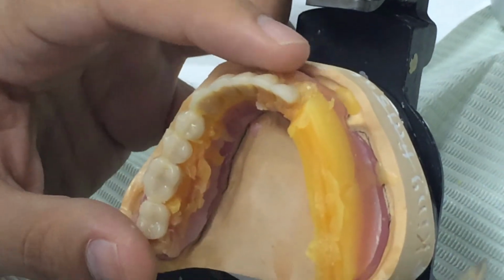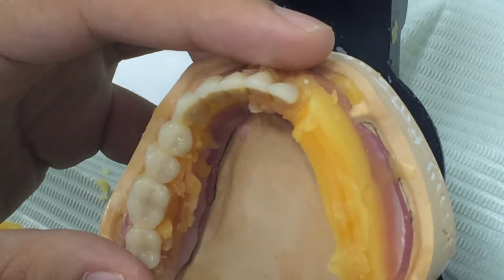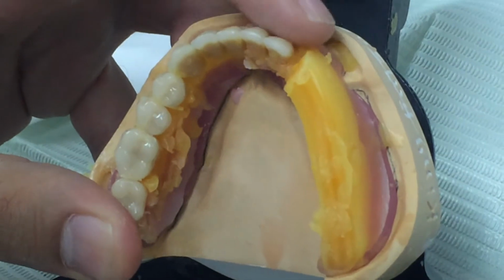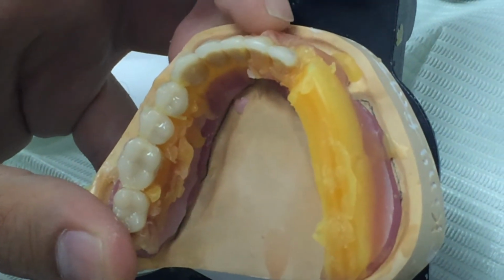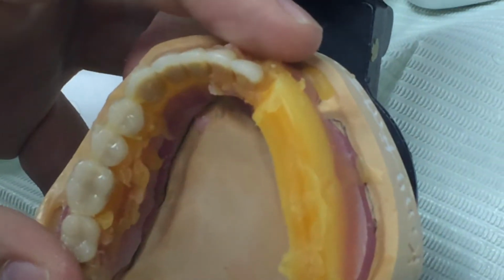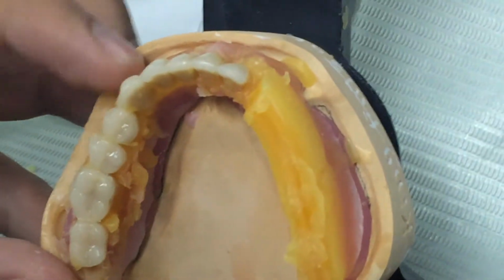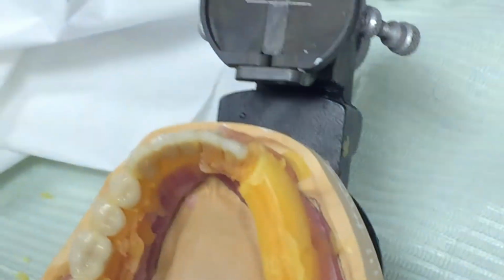So the next, you cannot see it clearly here, but you have seen it by your eyes, where you can easily determine. Let's say this is clear for you. This, the neck, you can see how it's in. Look at this canine. It's a little bit out. You can see the neck that it's out, right? And all from an occlusal view is doing the same curve.